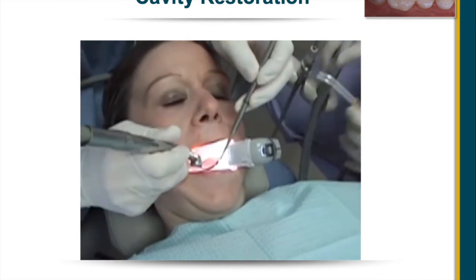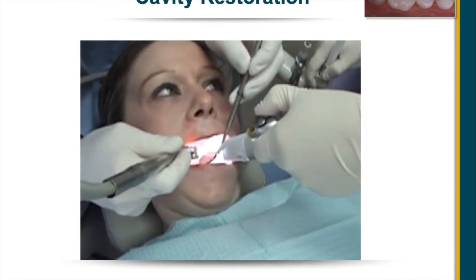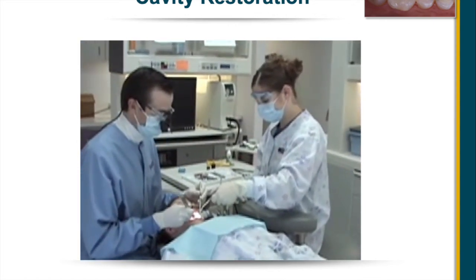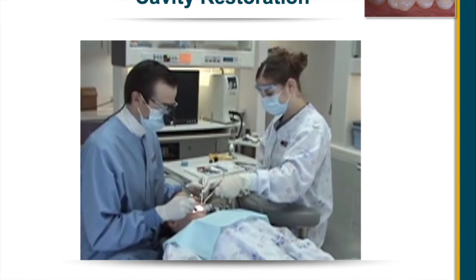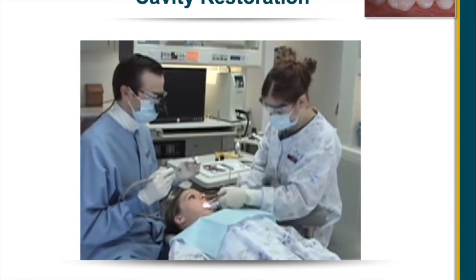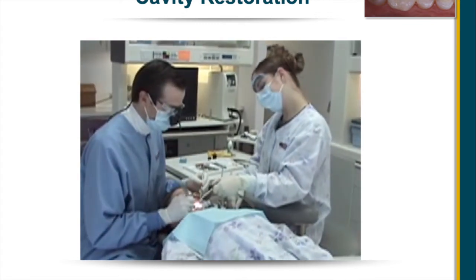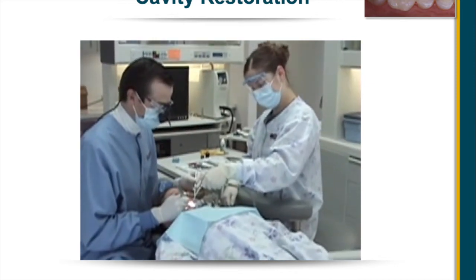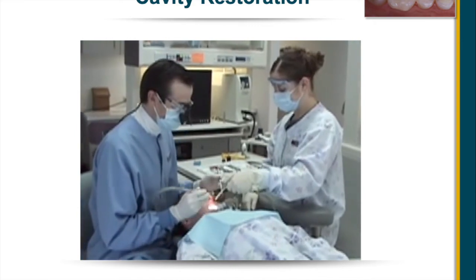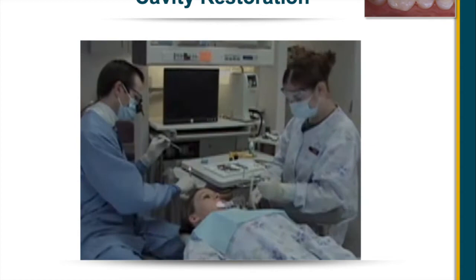The major difference for the assistant is the fact that the high volume suction is not required, although it is useful at times, so it should be maintained. But the assistant needs one hand simply to keep the mirror clean and then to rinse and dry the preparation when the doctor is not in the mouth. But again, the high volume suction is usually left in the holster unless needed to pick up large chunks of amalgam or eliminate overspray.